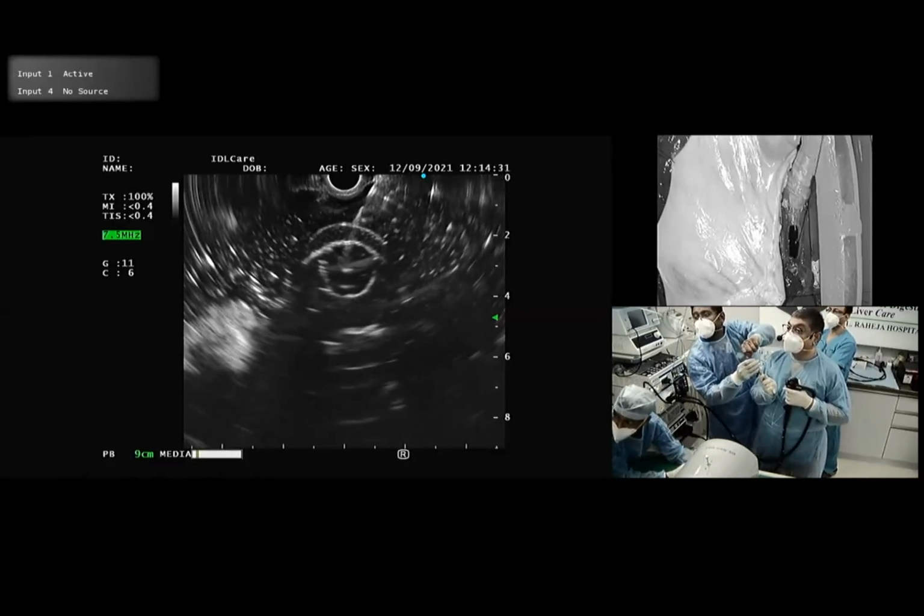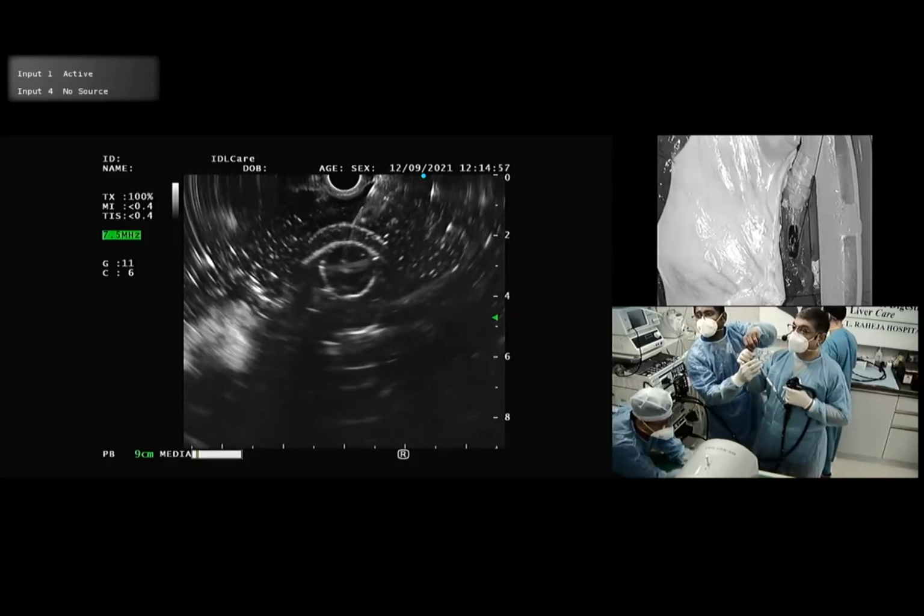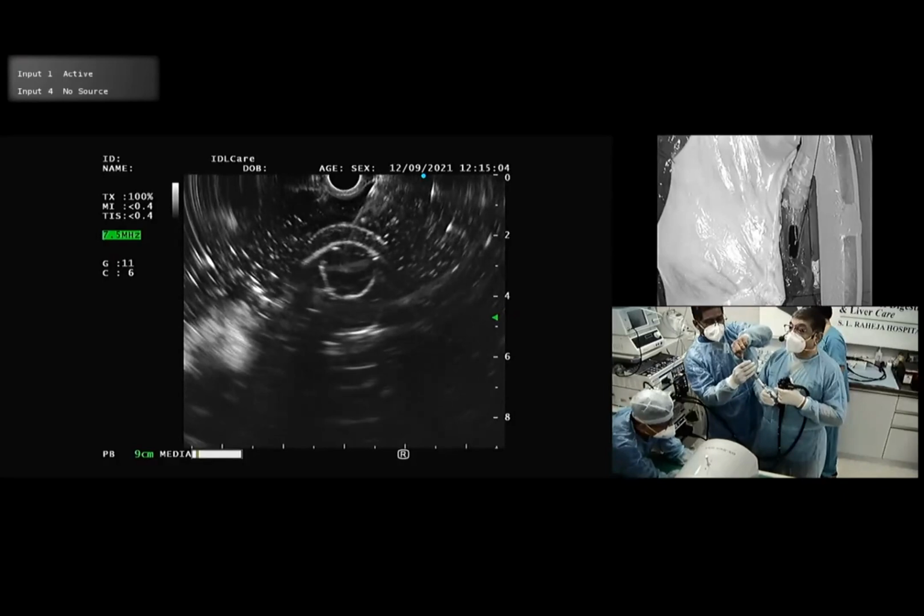And then again, you will see that the wire shears very easily if you push too much. So small amount. So Bibin got excited. He just pushed too much and now he's stuck. He cannot do anything to it. So these are all the steps that you have to learn. See, the wire is stuck now. So it'll shear. See, the wire has come out. So these are all the things which we need to learn. I'll puncture again.